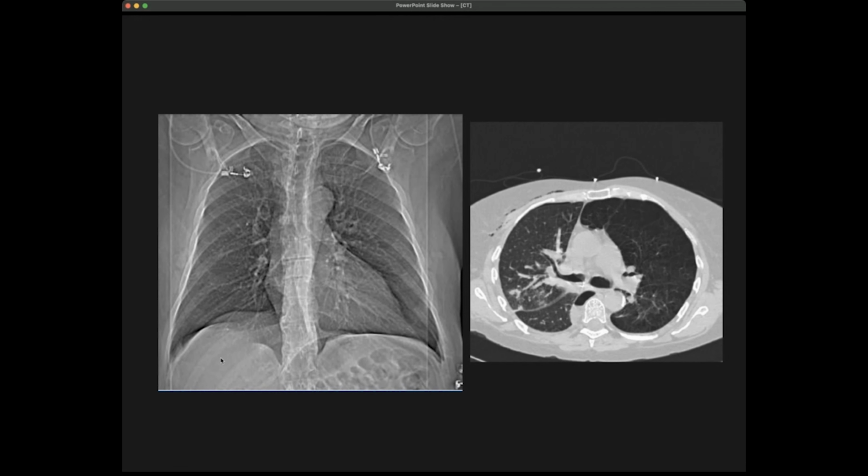So they would first make a classical X-ray scan like this, and then they would indicate, for example, from this slice to this slice, this block, I want to scan in 3D. Then they program the scanner, and the table or the width of the beam would be set in such a way that that's the only thing you scan, and there you make the cross-section. So that's how a typical exam would be.